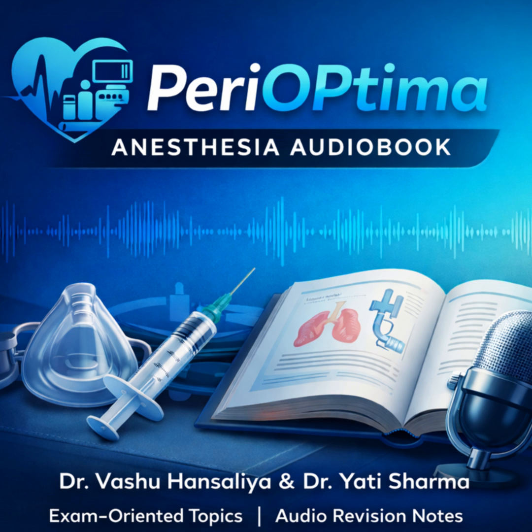Good distinction. What about heart support? IABP provides partial cardiac support. It requires some native heart function to work. VA ECMO provides full cardiac support. It can work even with a heart that's at a complete standstill. And lung support. IABP provides none. ECMO, both VV and VA, can provide full respiratory support.